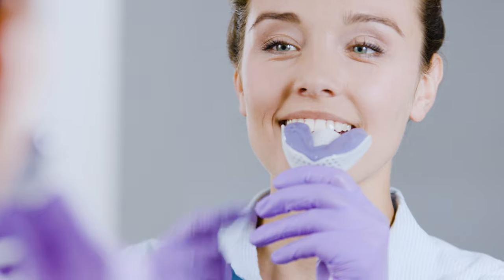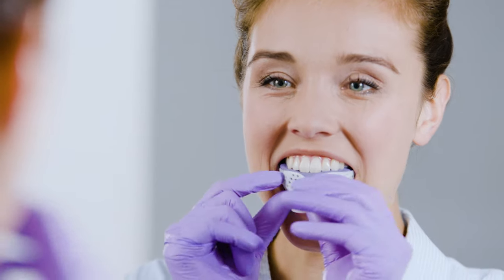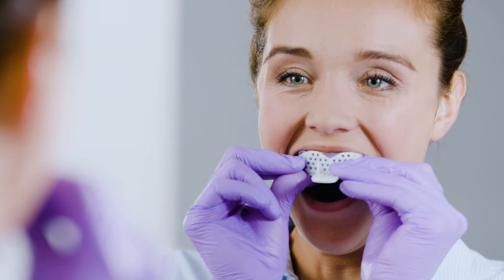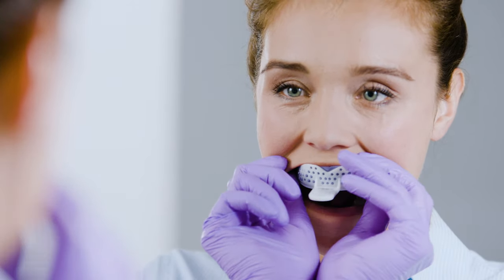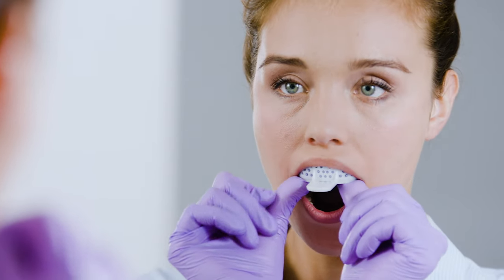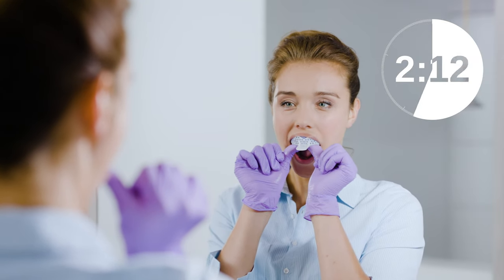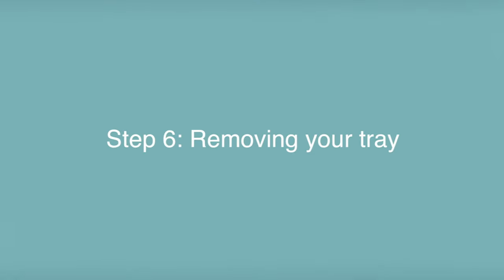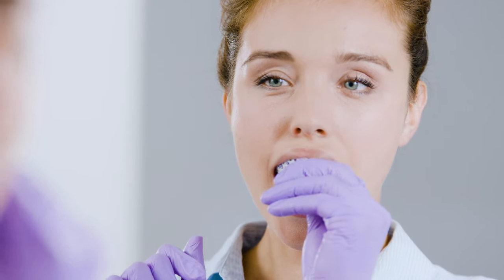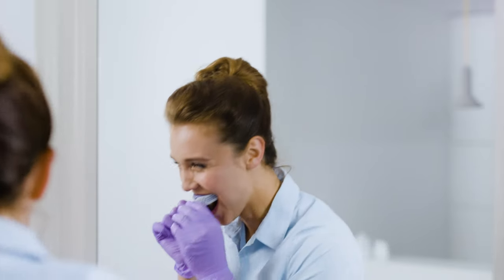Keep applying pressure along the entire tray until your front teeth and your back teeth are completely covered with putty. It's extremely important that your front and back teeth sink fully into the putty, ensuring that your putty reaches your gum line in the front as well as in the back of your mouth. Be sure to pull your lip over the putty and the tray and keep the tray in your mouth for three and a half minutes. After your timer is up, you can remove the tray from your mouth. The easiest way is to gently pull down on the sides of the tray and use the handle to remove. A bit of drool is absolutely normal.